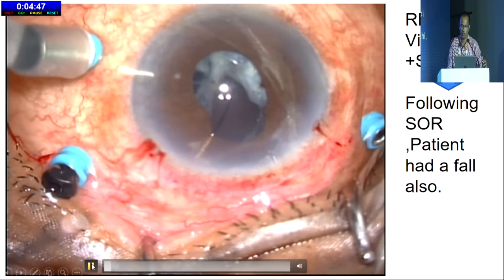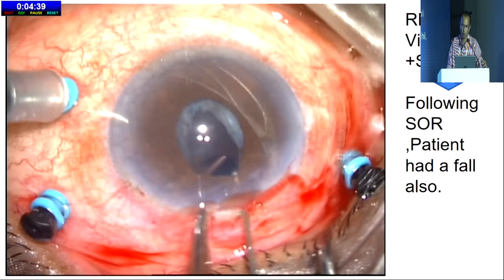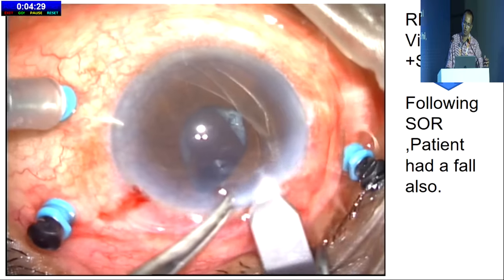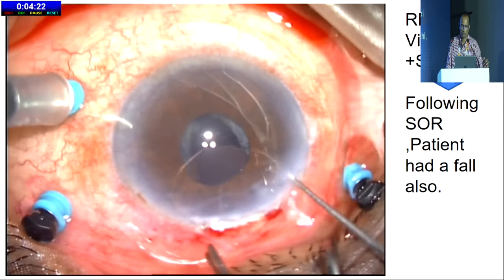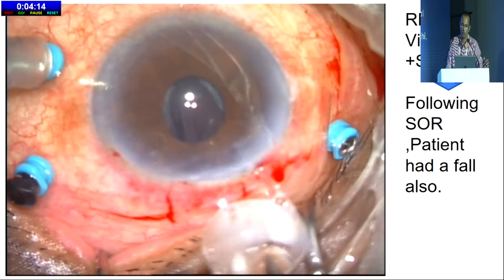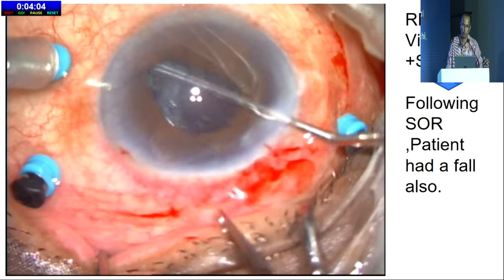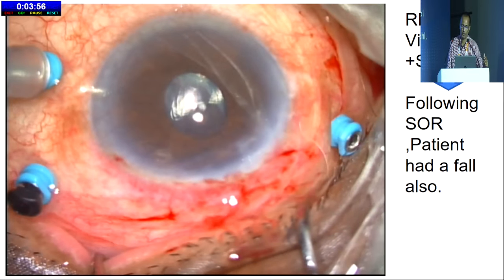So what was done in this case was that the IOL was just taken out through a keratome incision, a 3.2 keratome incision enlarged to almost about 6 mm. But there is sufficient capsular rim still remaining in order to support an IOL. So I thought maybe there was no need for actually going for a scleral fixation or iris claw. So another PMMA IOL of the same power was placed on the rim, and it was found to be reasonably stable also. Due to some manipulation during that primary vitrectomy, probably due to my fault itself, this must have happened. So now it is stable.